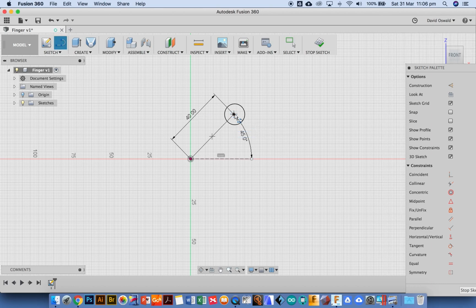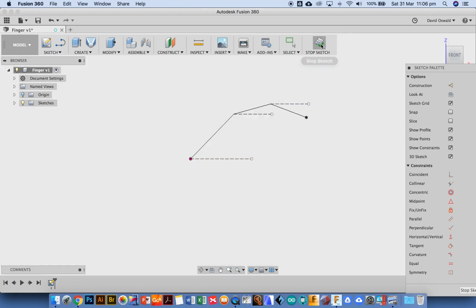Then line again, L. I worked out 25 was a good starting point. Hit tab. And I'm going to look at maybe 15 degrees. I'm just looking at my finger, the shape of my finger in front of me, just estimating the angles and the length of these parts. So I'm going to put 15 there. 15 might need to be just moved out a bit so I can see it clearly. I'm going to hit L again, and the end of my finger. Again, 25, tab, and I'm going to look at something like 20 degrees, and enter. Okay, so my first sketch is just this. So I go OK to that.